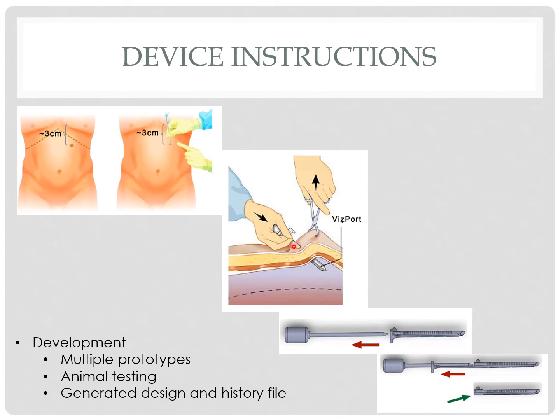The peritoneal tissue is lifted up. The catheter trocar system is essentially placed into the peritoneal cavity. This can be used with the endoscope in position or blindly and with follow-up endoscopic visualization of the peritoneal cavity. Insufflation of the peritoneum can be performed. The camera obturator is removed.